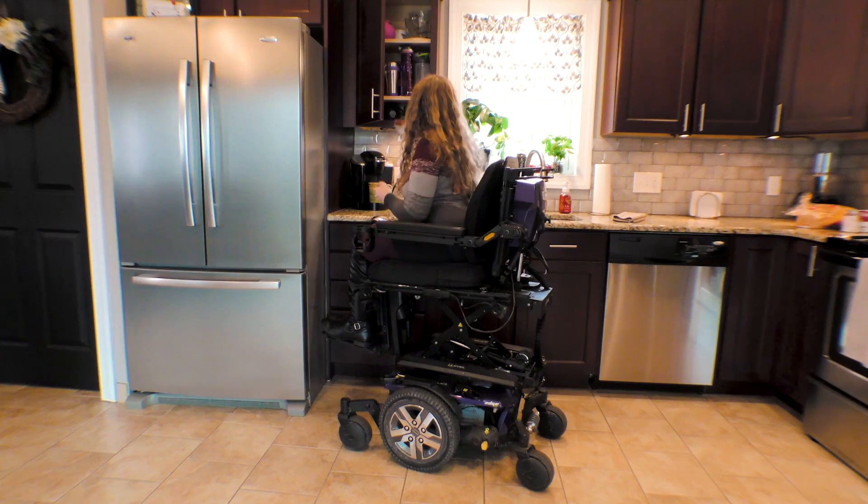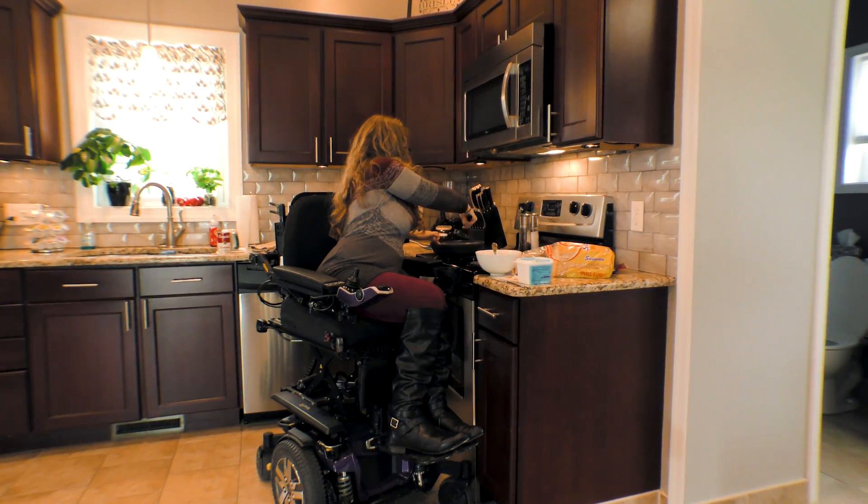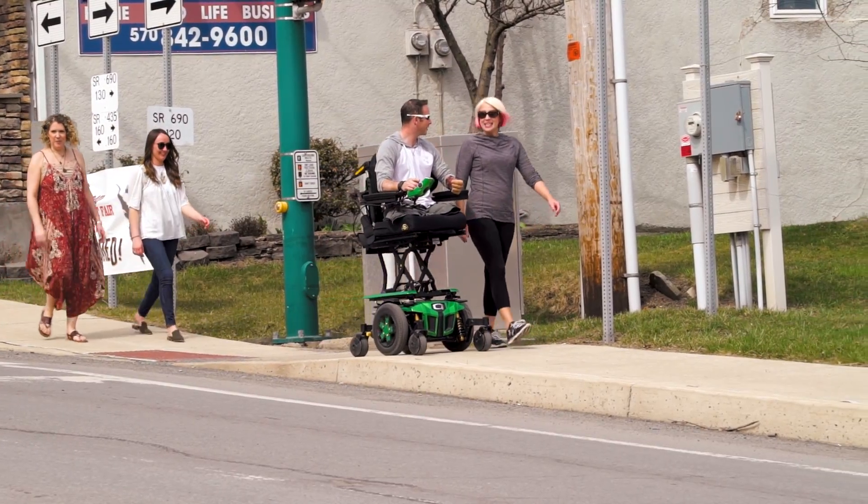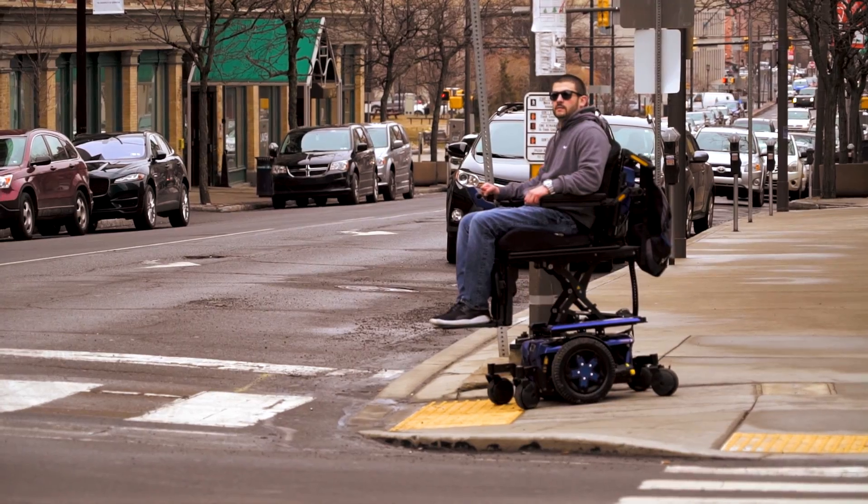iLevel can help with things like reaching a cabinet, cooking, transferring into a bed, talking to a friend while on a brisk walk, and quickly crossing an intersection.